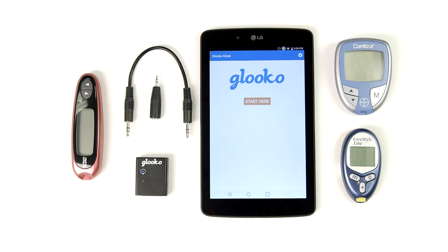Hey there, welcome to Glooko. Today I'm going to show you how to sync most of our supported blood glucose meters with Glooko Kiosk at your clinic.